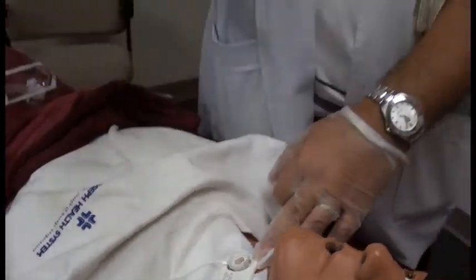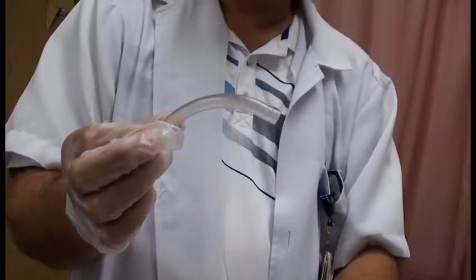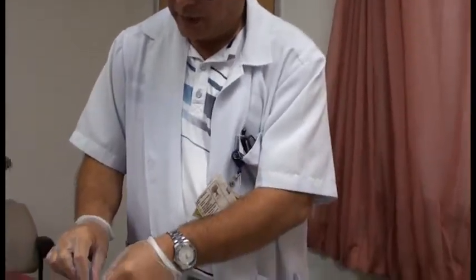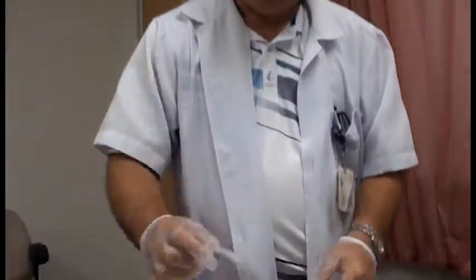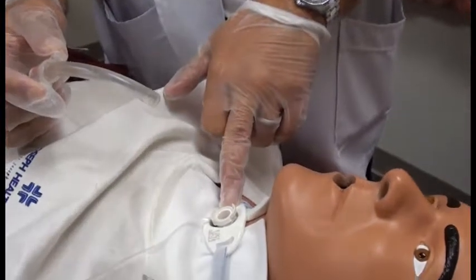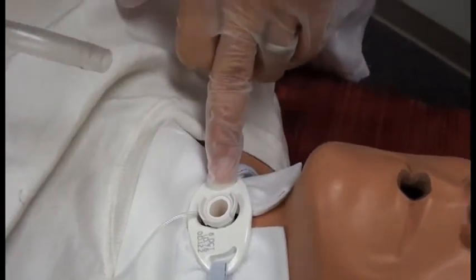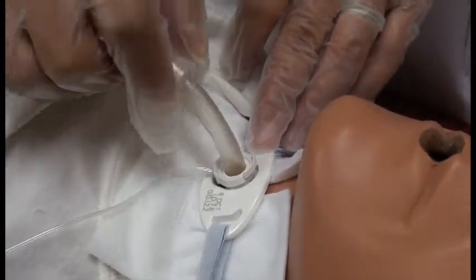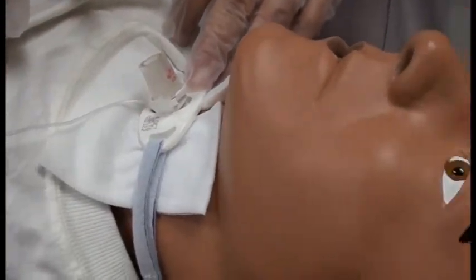And again, when I pull it out, I want to observe the inner cannula for any foul odor or any unusual coloration, that could be an indication that there is a respiratory infection going on. So I will also dispose of this. And my inner cannula, I'm just going to make sure that I hold the end of it. And again, there's a clip. So slowly, I'm also going to be looking at the tracheostomy itself. Make sure it's clean and there's no sediments or any kind of unusual mucus in there. And slowly just put it in there. And again, this just clips on to the tracheostomy itself.